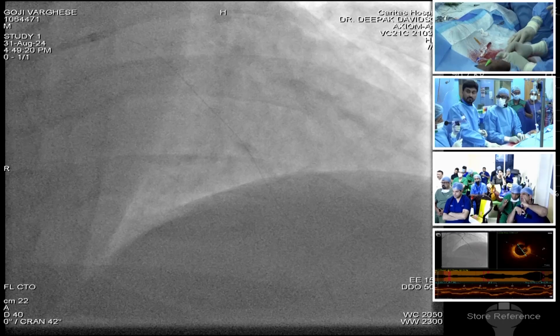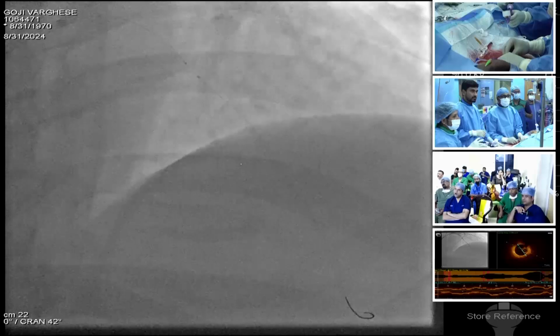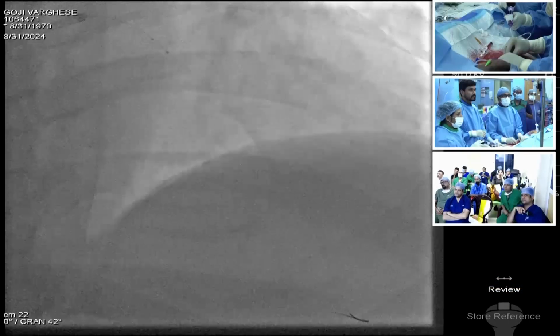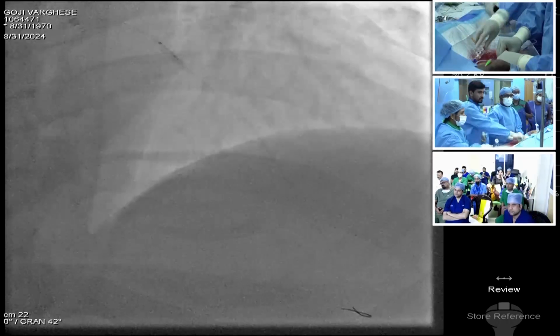Joel, distally 2.9. So we go with a 2.75 stent. Proximally, Joel, we want to see the vessel size. We'll go up. 12, 14, 16, 18. Negative.